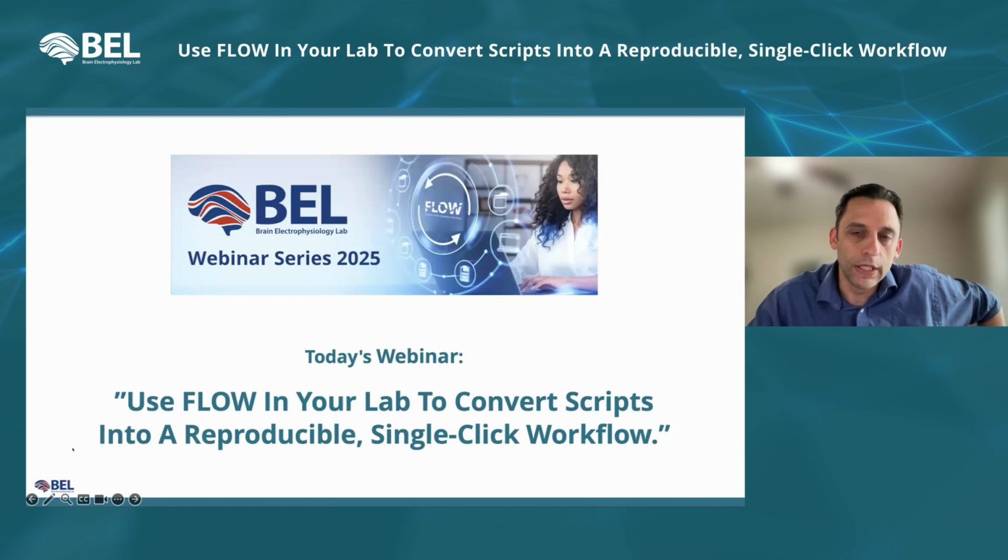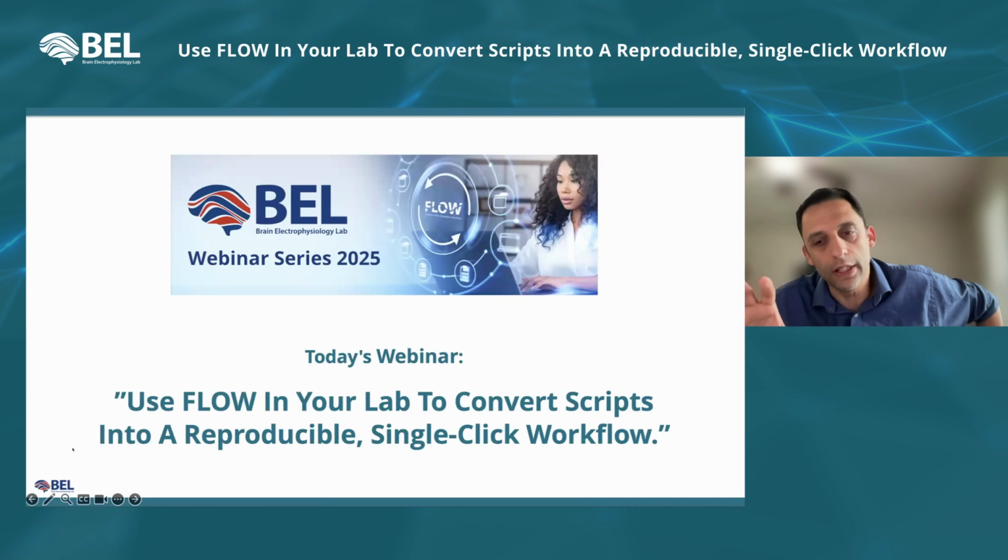There is a research type of account, where a lab who owns Flow and the Flow server can provide a research account to any external user. And a research account is actually linked to specific studies, so they can access only a defined set of studies.